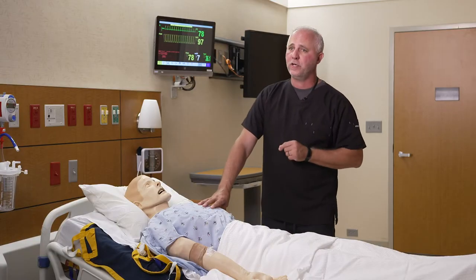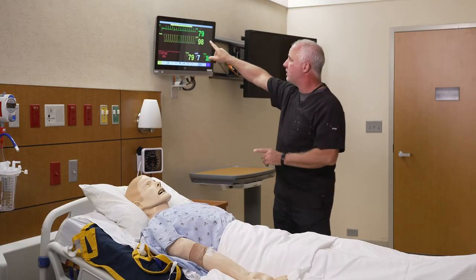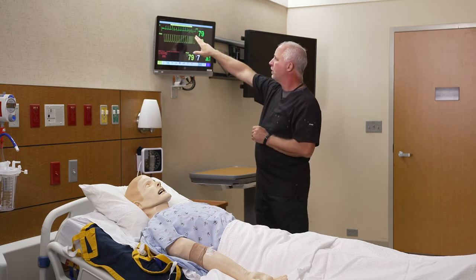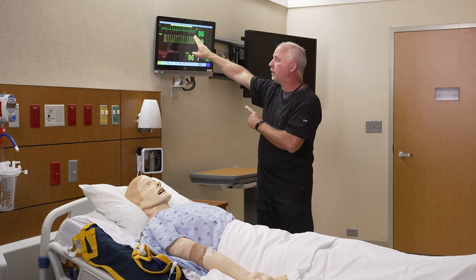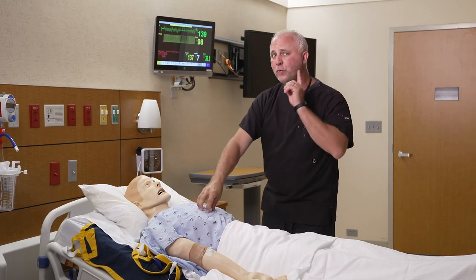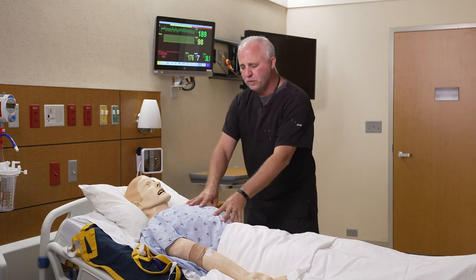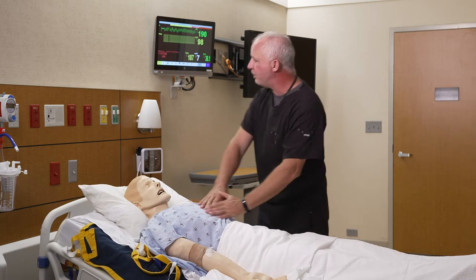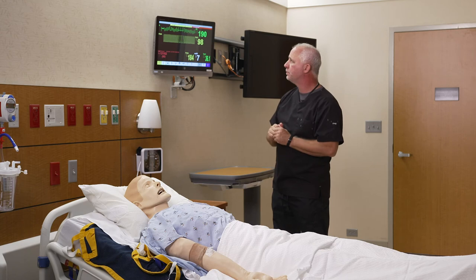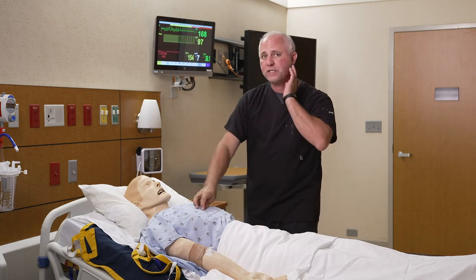One of the things he's very good at is code training. We can do full chest compressions on him. If he drops into VTAC, you'll see that the monitor flips to VTAC, but what's really interesting is if you put a stethoscope on the mannequin right now, you would actually hear a VTAC heartbeat. Then we could shock him — put the pads on, shock him, and he would come back to sinus rhythm. If we put the stethoscope back on him, we'd hear sinus rhythm as well.